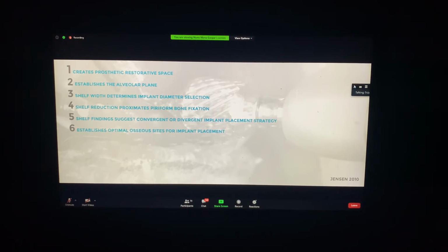Trong slide này thì chúng ta sẽ có 6 bước. Đầu tiên là thiết lập đủ khoảng để phục hình, thiết lập mặt phẳng xương ổ và tạo khoảng đủ rộng để có thể phục hình. Ngoài ra thì mình sẽ thiết lập mặt phẳng xương ổ theo đường vẽ.